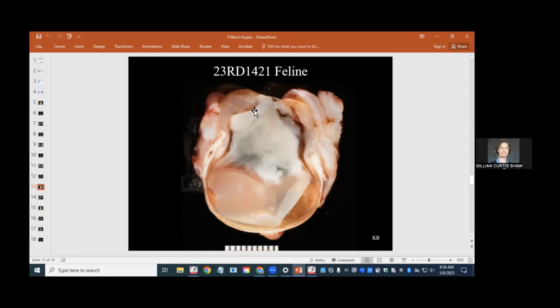This is all inflammatory exudate, which is obviously not surprising given that we don't have the corneal epithelial barrier or the Descemet's membrane barrier. We just have no barrier. It is an open space. So the globe is filled with pus, and the lens is not something that we can appreciate anymore. Given that it is free to move about the cavity, it is not surprising.